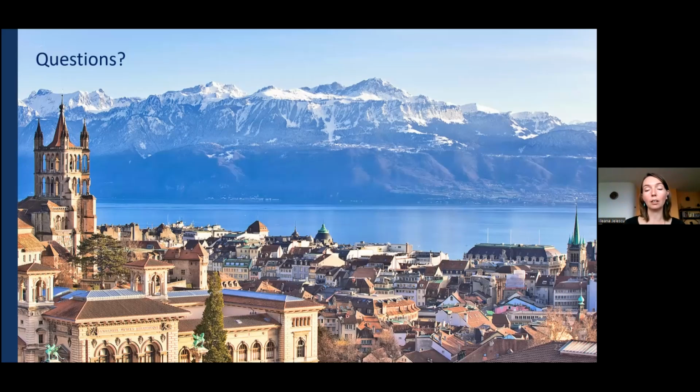Now, if you play more advanced waveforms, so not just a square, but time varying gradients with a certain shape that can be customized along the three axes, you can actually in one go impart diffusion sensitization in any subspace that you want, right? So you can do planar encoding, so you'll impart diffusion sensitization in an entire plane at once. And you can even do spherical encoding, which means you will impart diffusion sensitization in absolutely all directions of space in one go. And this is very different from actually doing a trace measurement, like doing diffusion sensitization in three different directions in separate acquisitions, right? This is not at all equivalent.